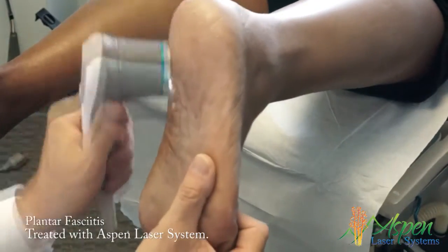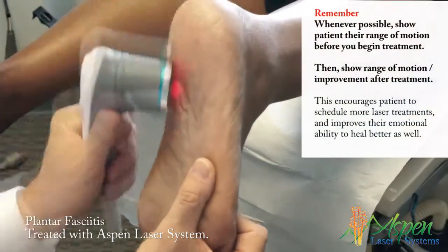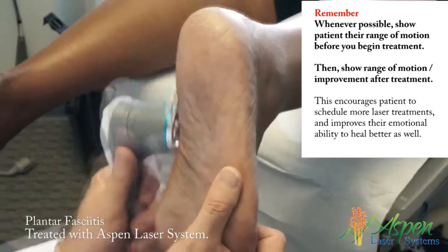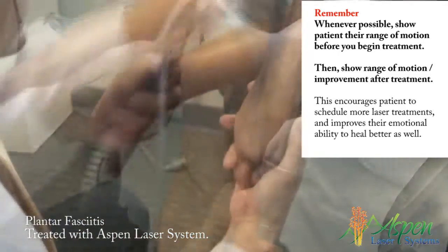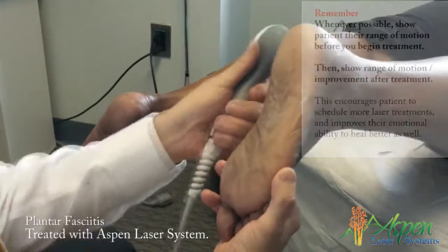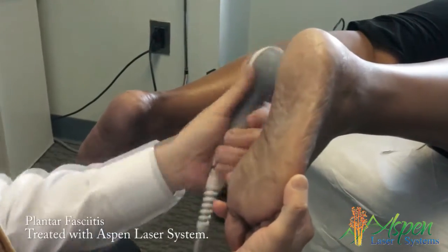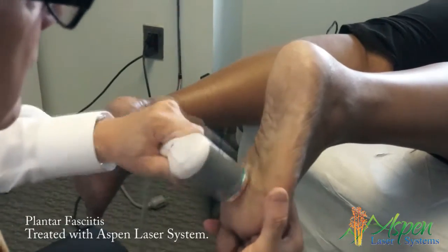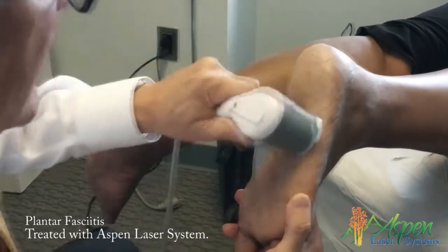And a little bit right there where the surgery was. We want to get the lateral band, the medial band, up through the tarsal tunnel — the posterior tibial, the tarsal tunnel, the medial band. That's not tickling you, right? That's amazing.